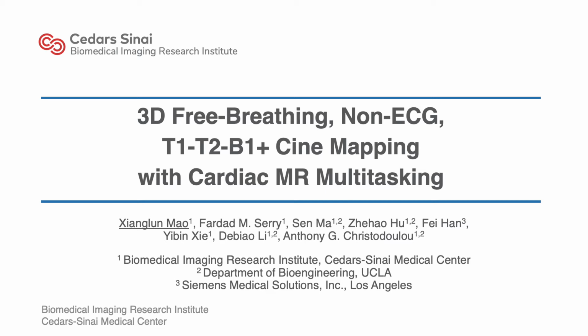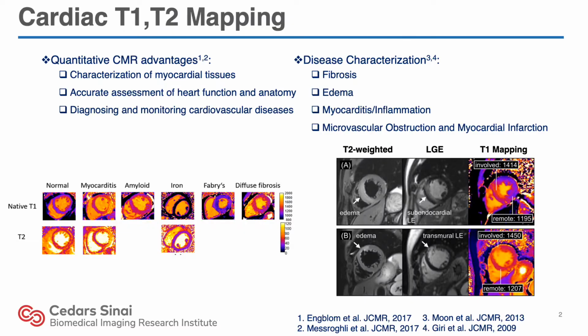This is Xianglun Mao from Biomedical Imaging Research Institute at Cedars-Sinai Medical Center. The topic of this presentation is 3D free-breathing non-ECG T1, T2, B1+, cine mapping with cardiac MR multitasking.